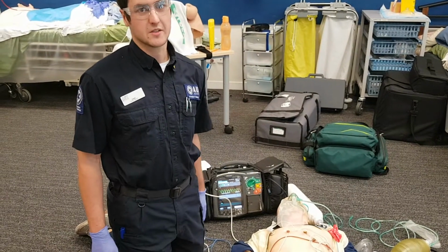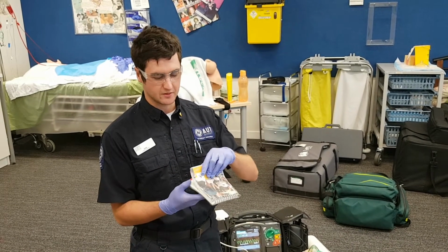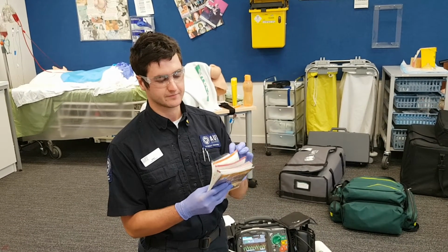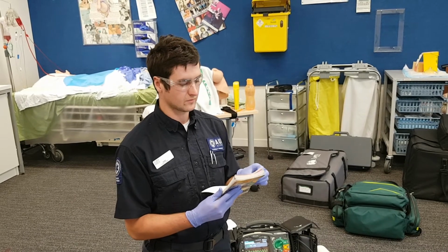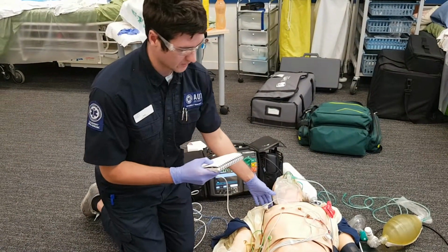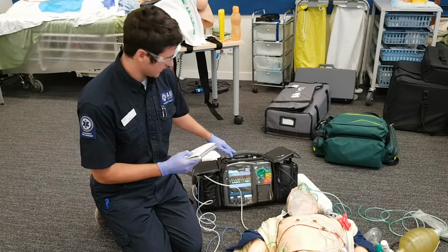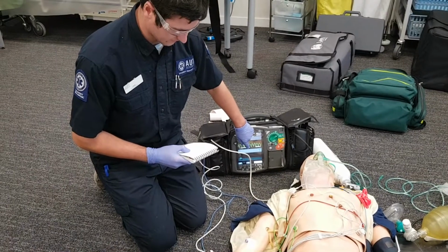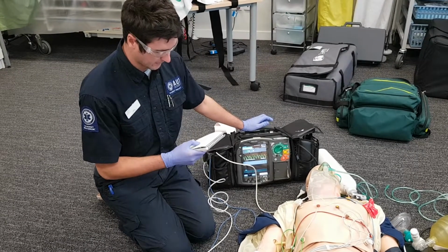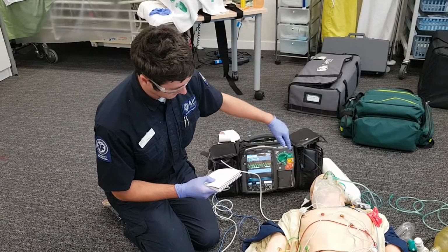In order to cardiovert my patient, I will pull out my pocket CPGs and turn to page 127 to follow the cardioversion checklist. I will place pads either side of the apex and sternum. Ensure my defibrillator is in manual mode. Select the lead with the visible R wave as seen here. I will select synchronized mode and allow it to sync, confirming that there is a detection symbol above every QRS complex.